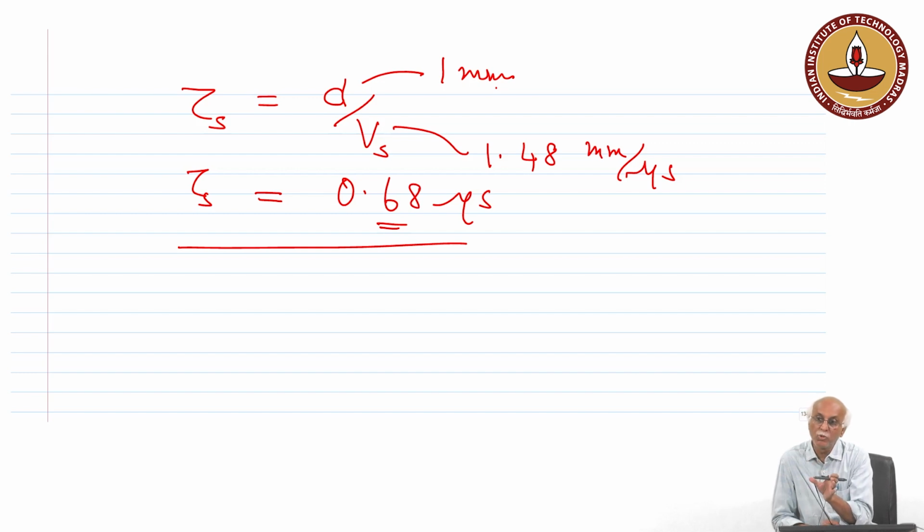In that case the modulating frequency should be such that the time between pulses is less than this, approximately. So it will be in terms of kilohertz, a few hundred kilohertz or megahertz, so as to induce the thermal heating effect. Is it okay?